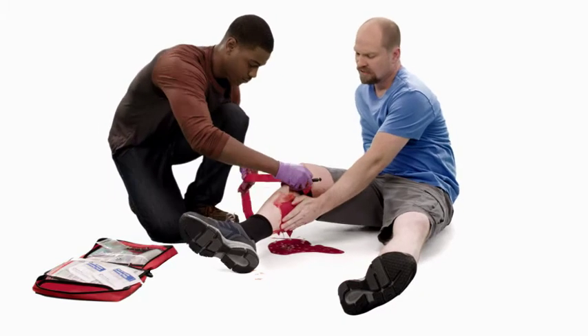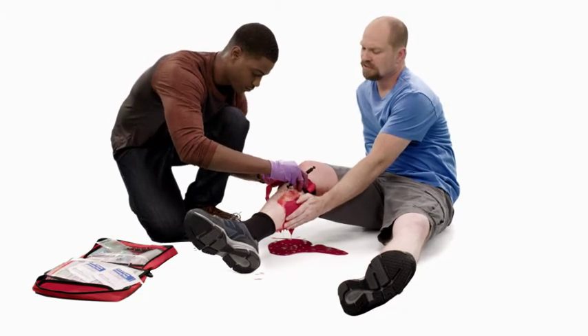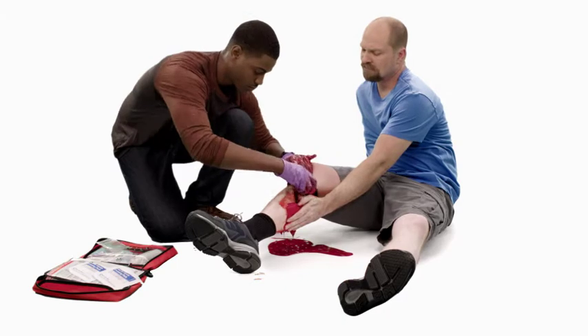Route the tag end of the strap through the buckle or attach the quick connect buckle and pull the strap until tight around the arm or leg.